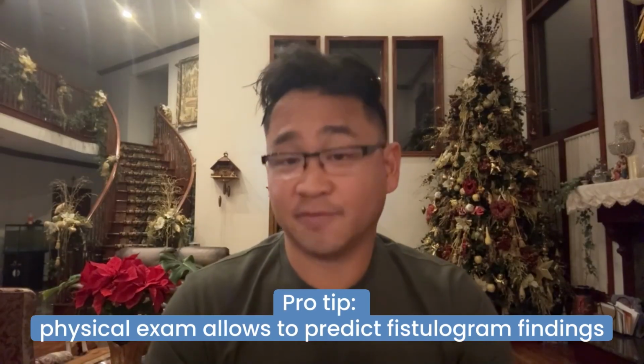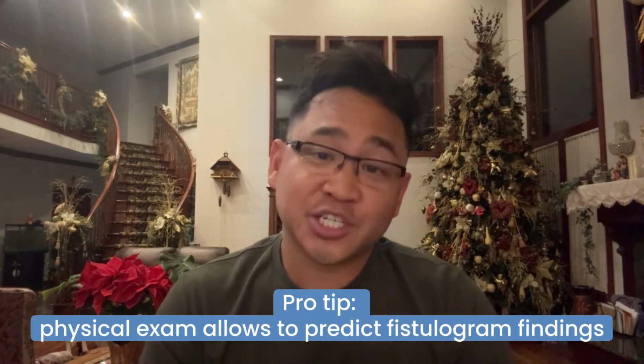Now, one thing I do want to mention is that a lot of these findings that you will see on the fistulogram when you are in the procedure can be predicted based on the physical exam. So, when a patient comes in, you want to get as much information as possible. You want to see what kind of fistula or graft it is. You want to know how long they've had it for. You want to know how it presents when you palpate and auscultate the fistula, and that'll give you an idea of what to expect.